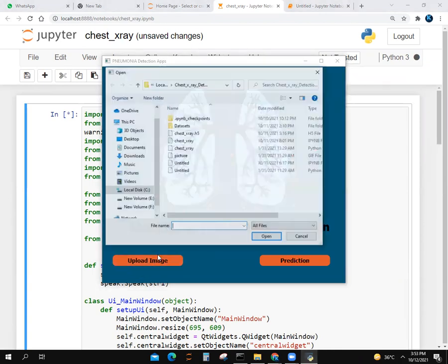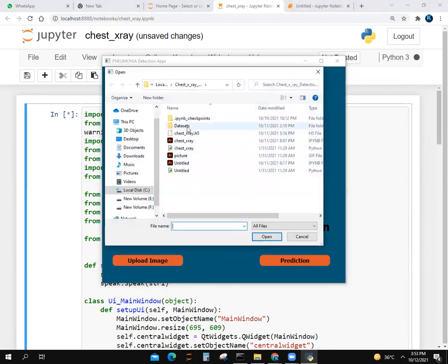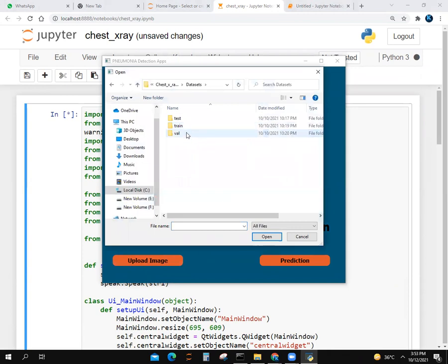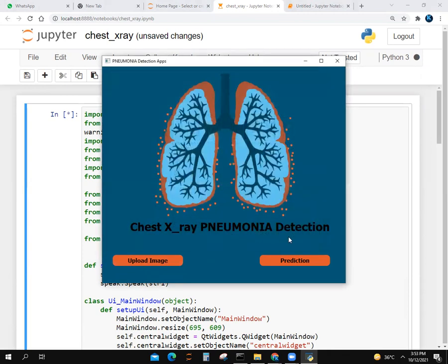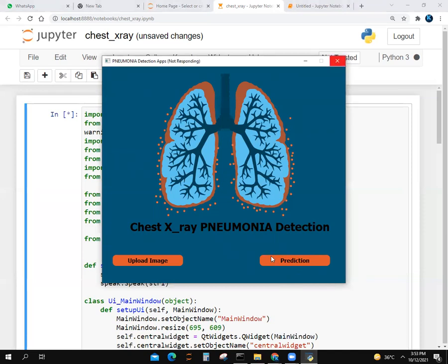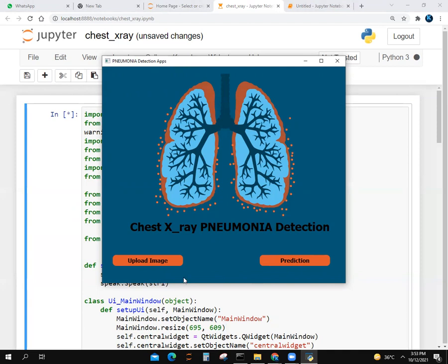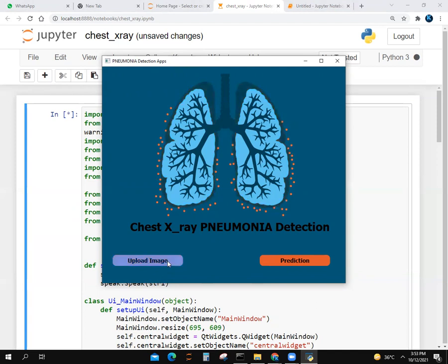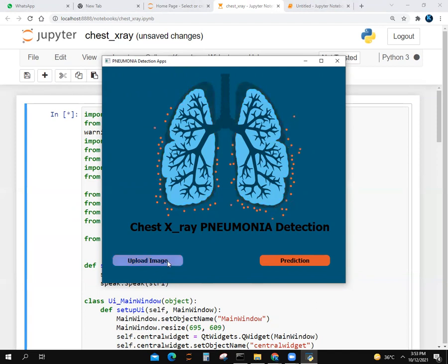Let's upload an image. We go to dataset, validation, and then normal. Prediction. It will take one to two minutes. It's running. It says result is normal because we took the image from a normal folder.